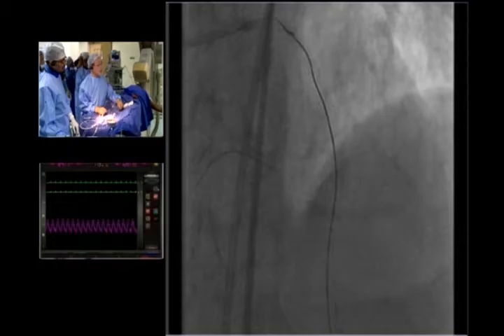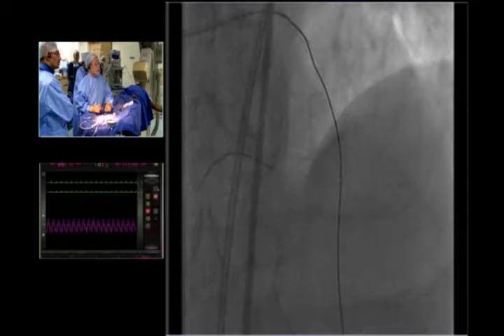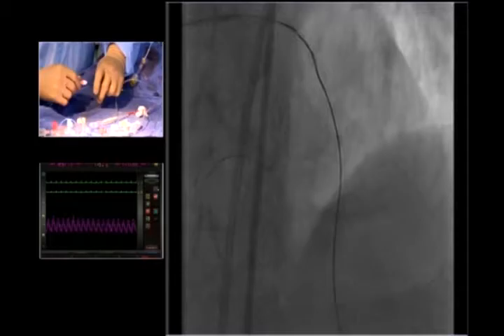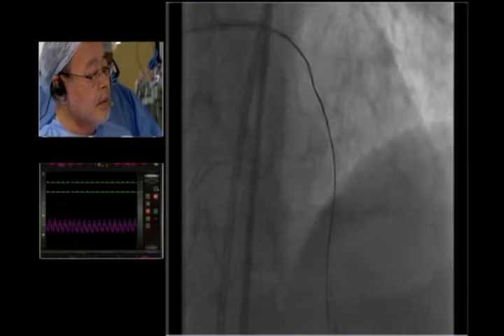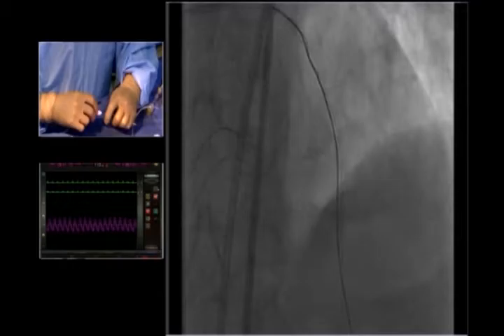And this is a combination of XTA with Caravel. Okay. Actually, also try to move the wire within this microcatheter. Okay, Caravel is going in, and here I'm trying to put this wire parallel to the device. Keep that 1.25 Sprinter balloon. Okay. Sprinter. I'm putting Caravel. But I cannot advance the Caravel anymore.